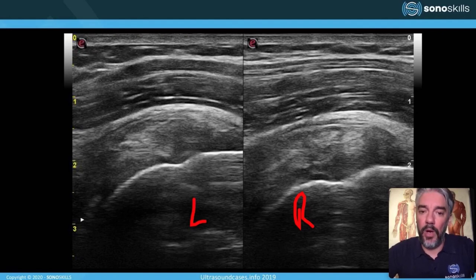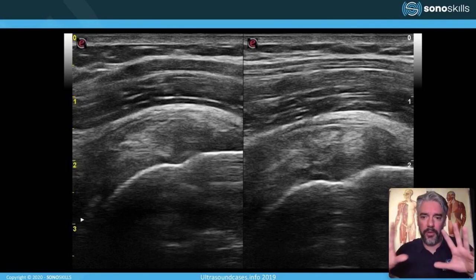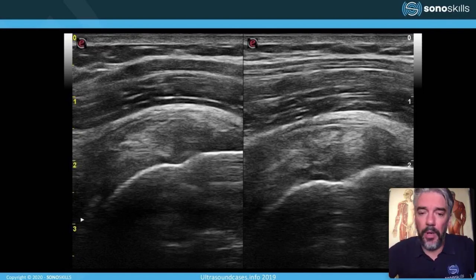Especially on the right, the thickness has changed, measuring from the collum anatomicum, the anatomical neck, to the top of the tendon. We can see that the echogenicity is not so homogeneous, so it's quite scattered, with hyperechoic, hypoechoic, and maybe even some anechoic parts.